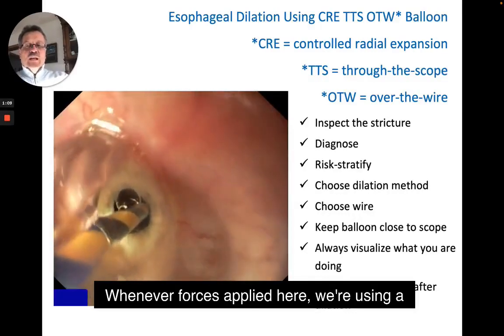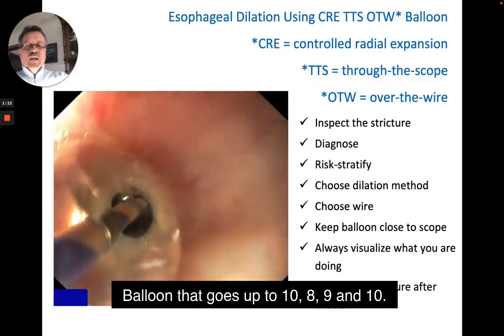Here we're using a balloon that goes up to 8, 9, and 10 millimeters.